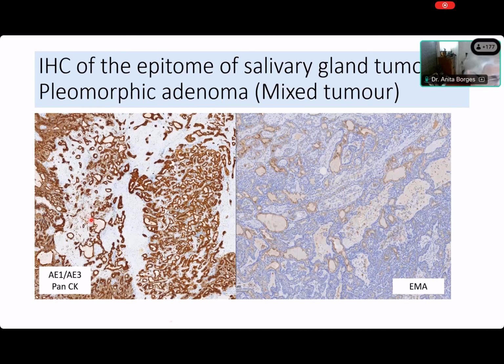All right, come on, Madhu, will you please tell Shivani what she wants to say? What is there in this pan-CK? What has taken up, or is pan-CK expressed in what? Madhu, are you there? Madhu's also disappeared. Okay. Akshara? The luminal epithelial cells are highlighted by pan-CK, ma'am. I see. That's what Madhu says. All right, Akshara? Ma'am, I said that. Oh, you said that. The luminal epithelial cells.